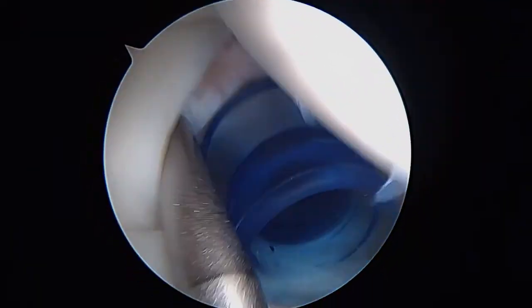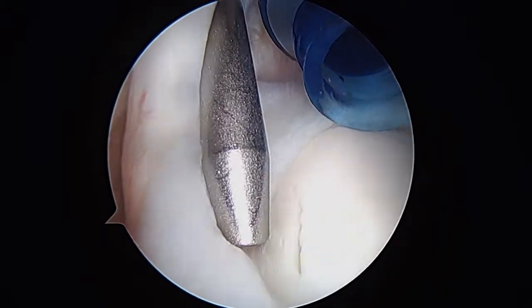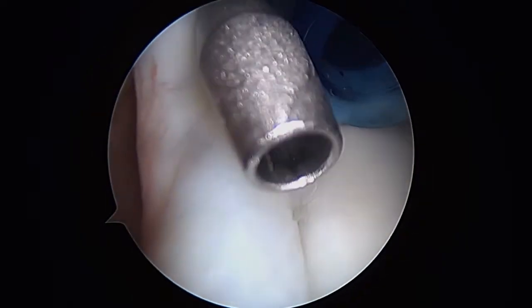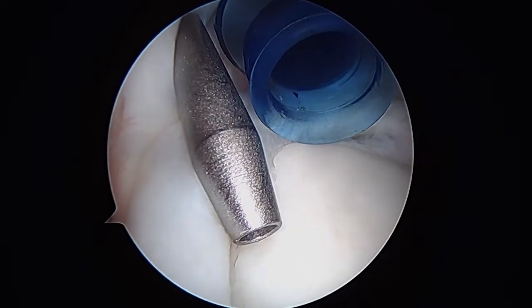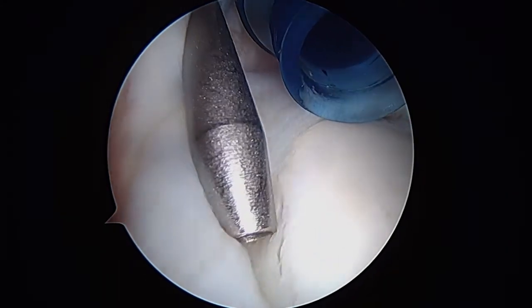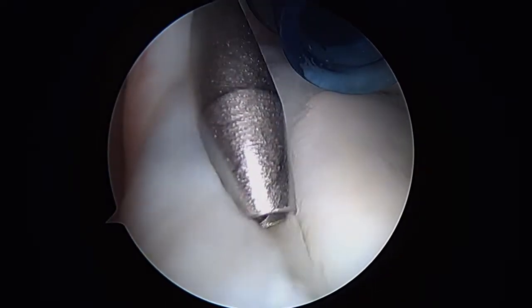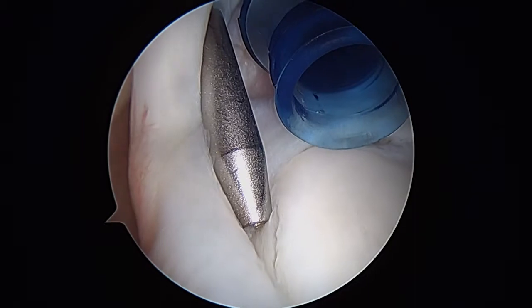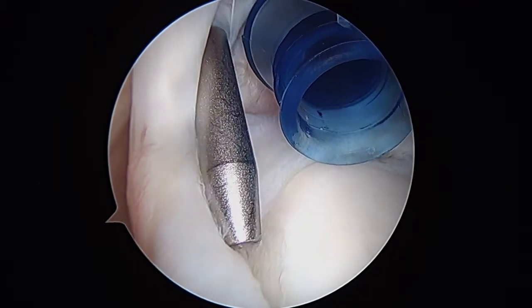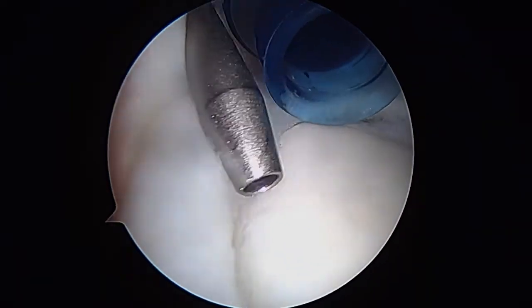As we look down at your biceps anchor, I'm a little concerned that you may have what we call a SLAP lesion. Look, as I pull back on this, you can see how the cartilage is cracked. The tip of that cannula is only about two millimeters, just to give you an idea of size. But you can see this is evidence that there's been some repetitive kind of traction injury here. And especially given that you have a very loose shoulder, I think it would help us to stabilize this superior labrum where this biceps tendon has been pulling.